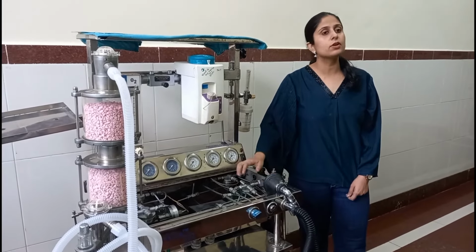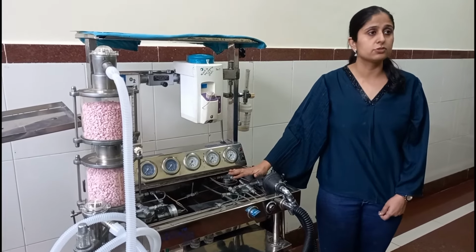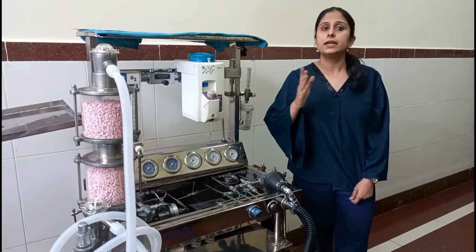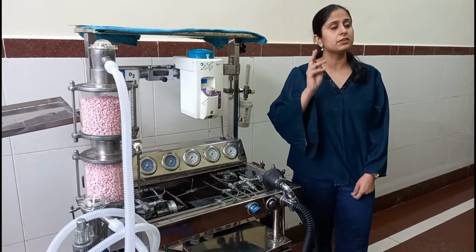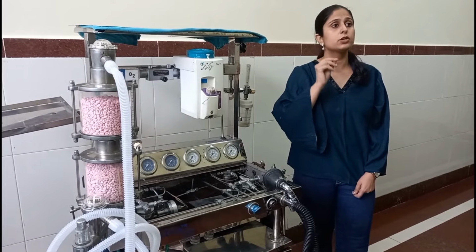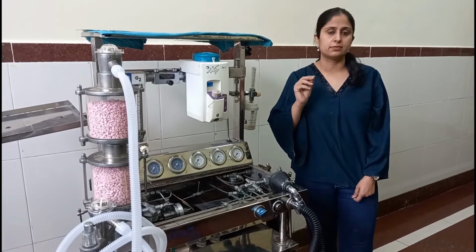Now first of all, before I start discussing the machine, there is a pressure system which has to be discussed, which includes the high pressure system, intermediate pressure system, and the low pressure system. High pressure system, please remember, has oxygen at 2000 psig and nitrous oxide at 760 psig.